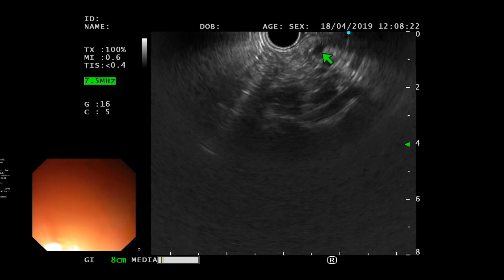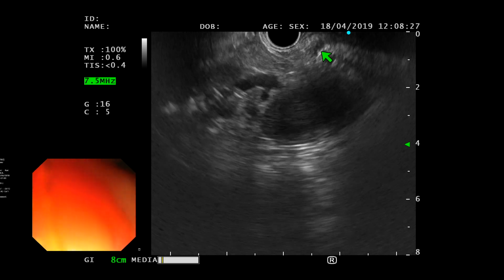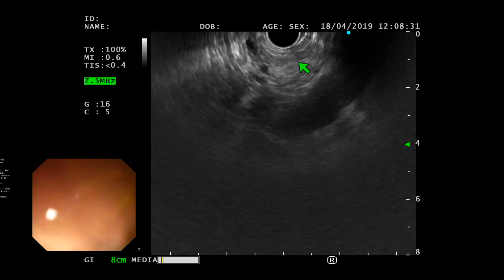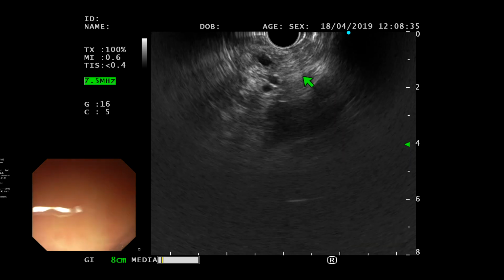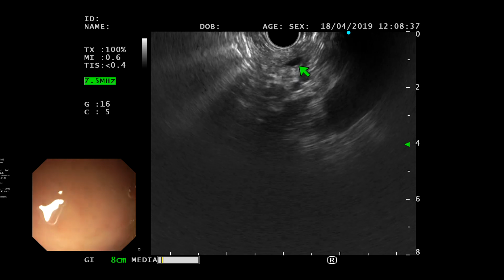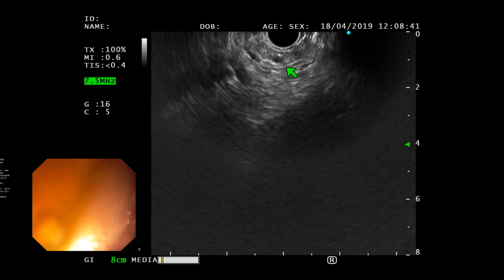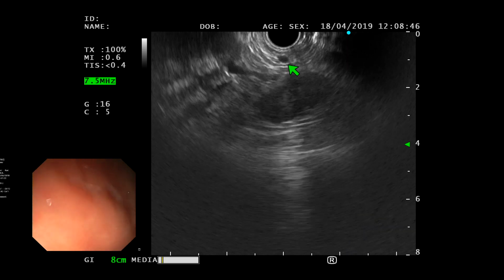Yeah, so now it's on this side. So keep going clockwise. You have to pull back a tiny bit now because you got too far from there. Oh, so that's a very small movement. Yeah, that's exactly it. And sometimes we'll do that. It's okay. Now? That's perfect, right? You can see it in the middle. You see it slightly dilated, and then you go clockwise. Then again it is slipping, so I need to push. Maybe push forward, maybe push a bit.